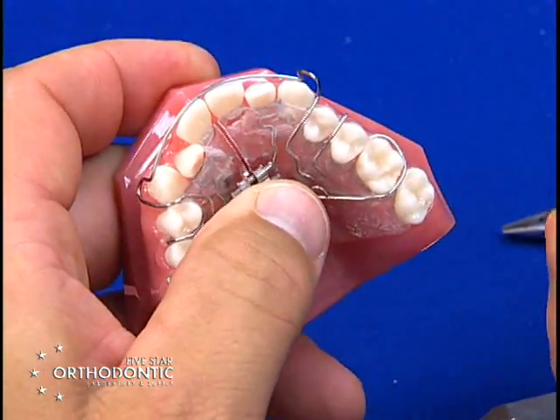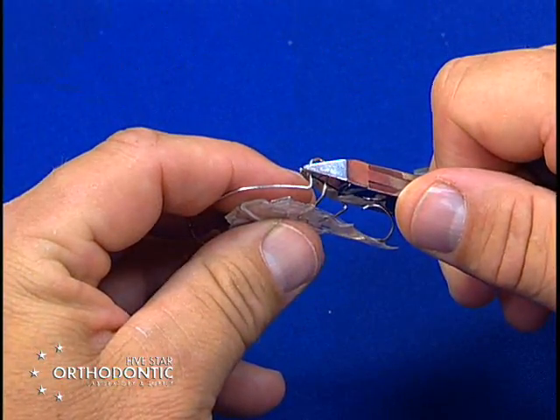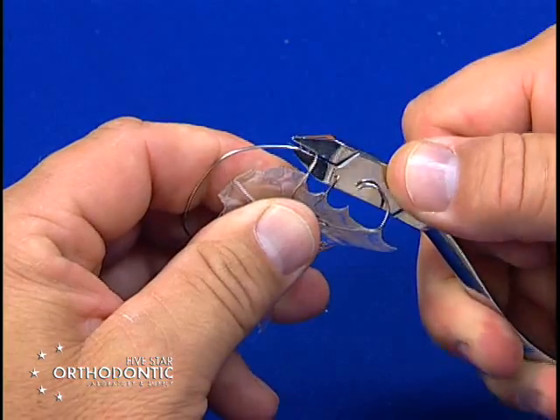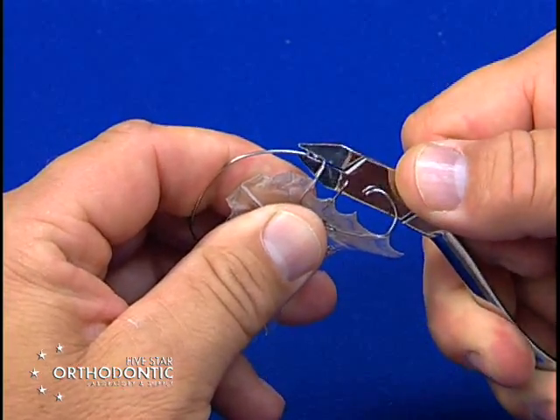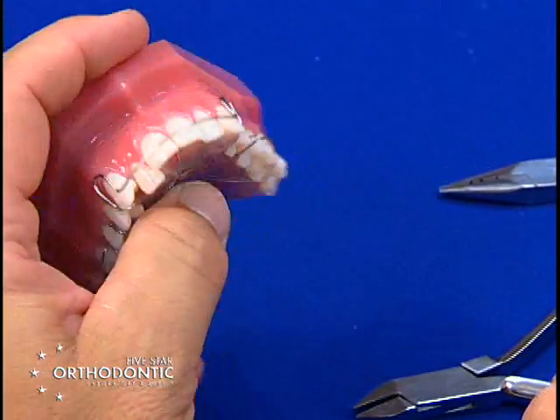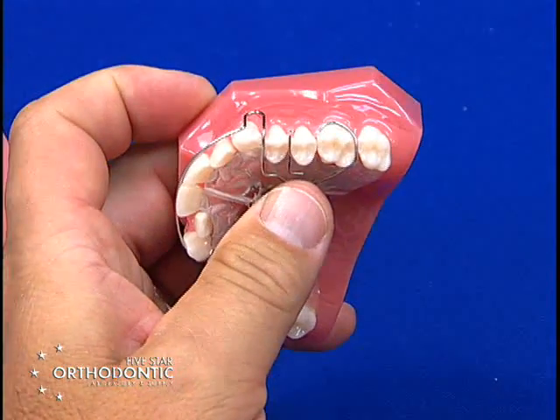If the bow is sticking out too far, take the top of the labial bow and turn it toward the tissue by twisting the plier — this will bring the bow back into contact so it's not impinging on the cheek.